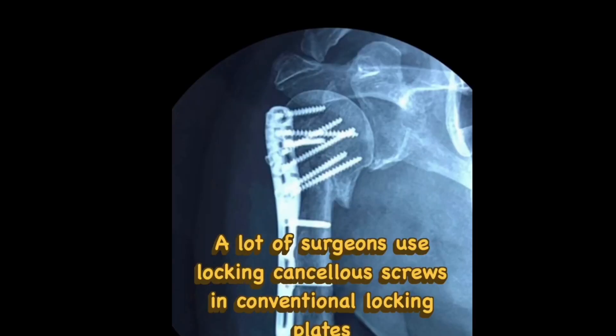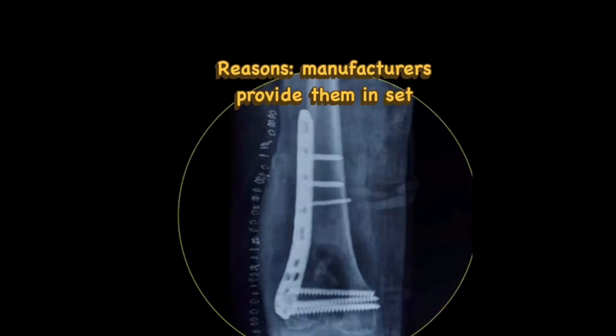Recently, many surgeons have started using locking cancellous screws in the metaphyseal zone when they do peri-articular fracture fixation. The query is whether the cancellous screw in the locking mode is an innovation or just a mistake. Here you can see all the screws placed in the proximal segment are cancellous screws, and here as well, all the screws in the metaphyseal zone are locking cancellous screws.